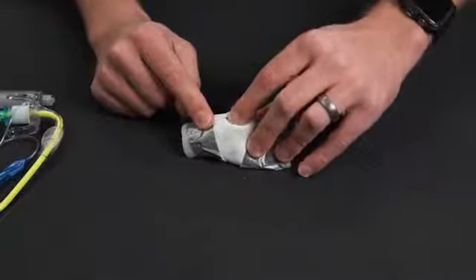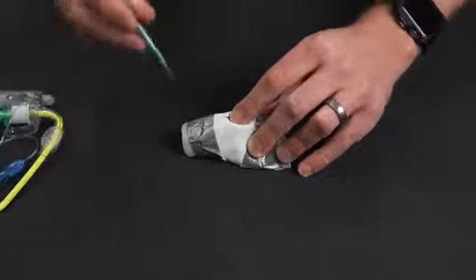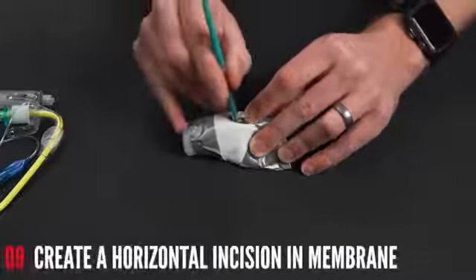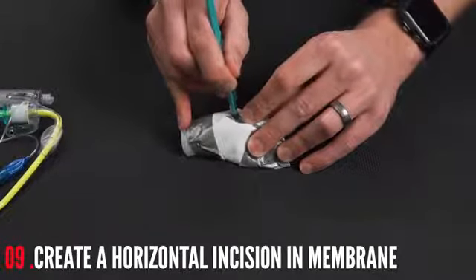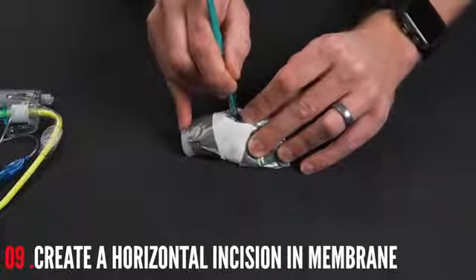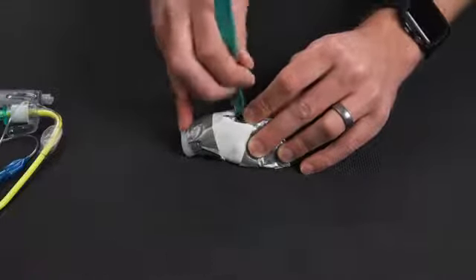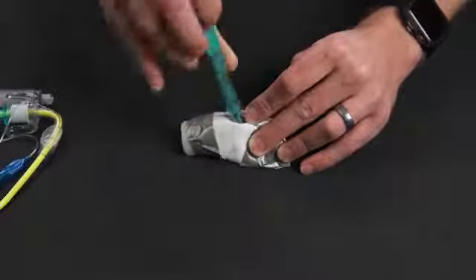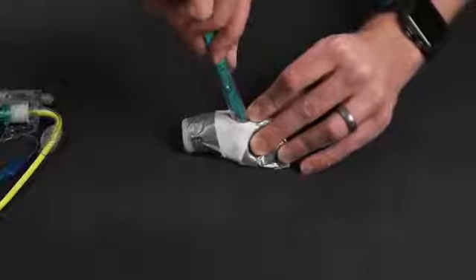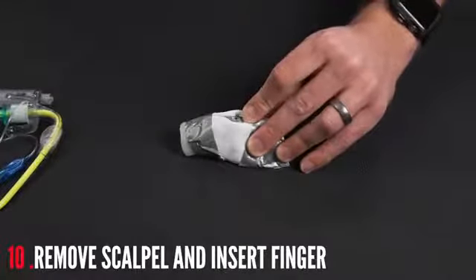So through here I have that space. I'm going to take this scalpel back up, and now I'm going to make a puncture down into that membrane, and I'm going to take it to the edge of the membrane. Now you will be stopped by the cartilaginous edge of the cricothyroid space. I'm going to turn the scalpel and I'm going to cut the opposite direction. We're going to remove this scalpel. Never put your finger in that hole with the scalpel still in place.